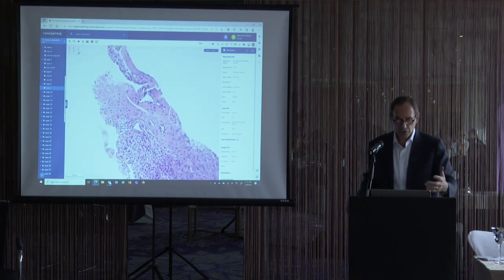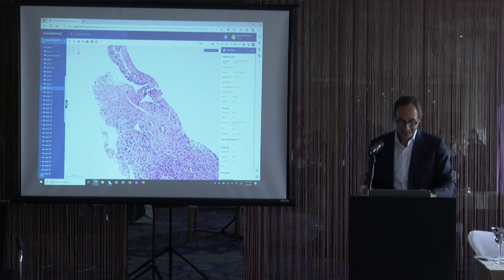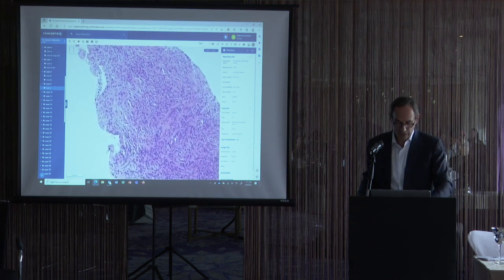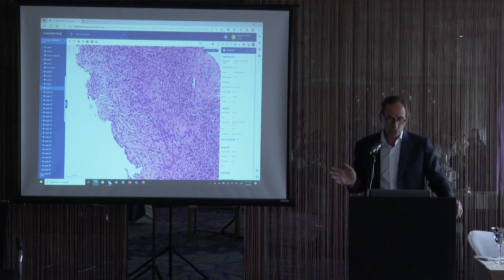In a resection specimen, you would be able to appreciate that it's multinodular, which would also be the clue that it's stromal BPH. On a needle biopsy, you don't have that, so what you have to rely on is identifying those vessels. Immunostains aren't helpful. Stromal tumors and normal stroma stain the same: ER, PR, CD34 positive.